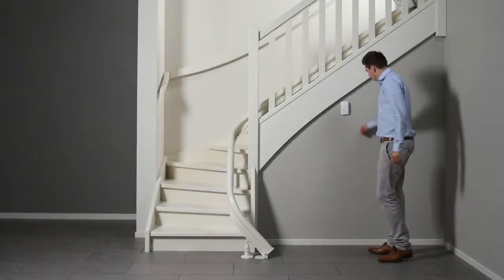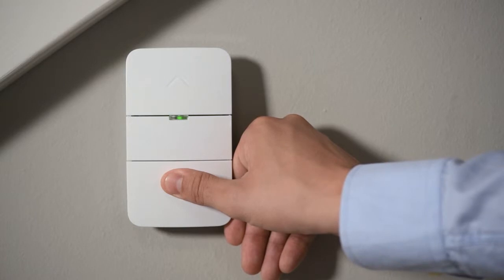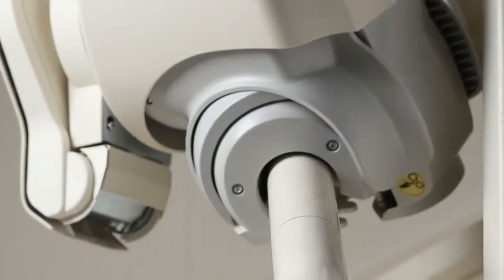Operating your AutoLift Air is simple. Bring the lift to you by pressing the button on the remote control.